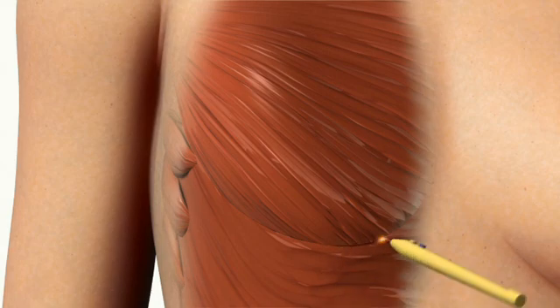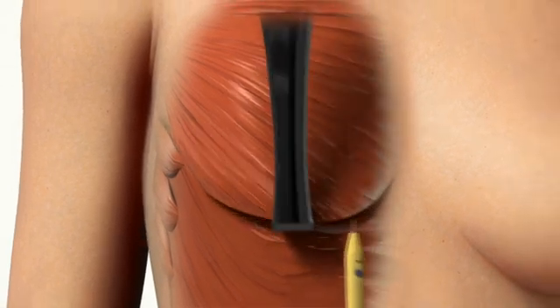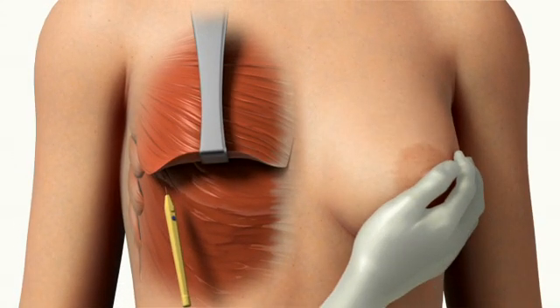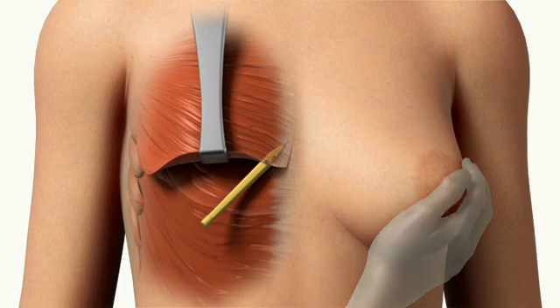First, the plastic surgeon lifts up the pectoralis muscle to form the upper part of a pocket under the muscle where the implant will be placed. The surgeon uses the contralateral breast as a guide during this part of the procedure to create symmetry in shape and size of the new breast.